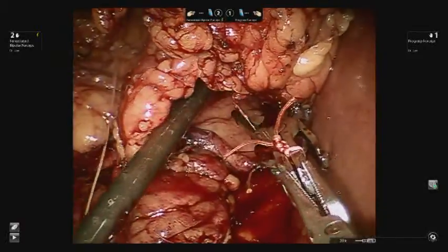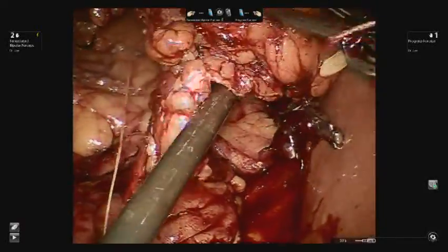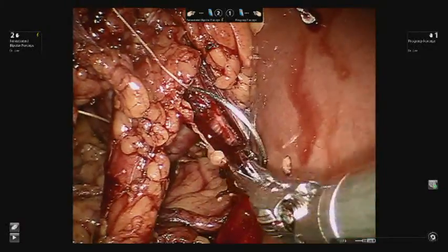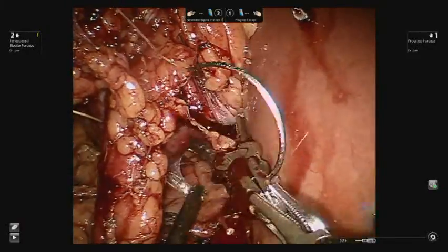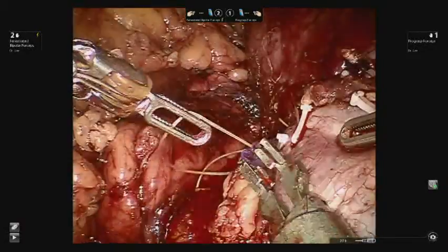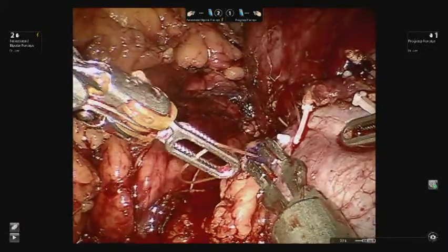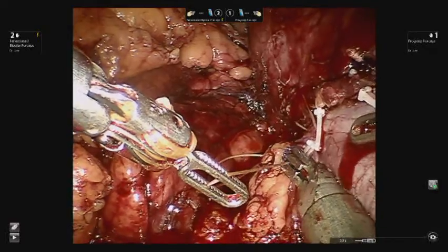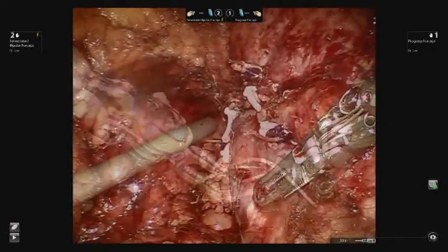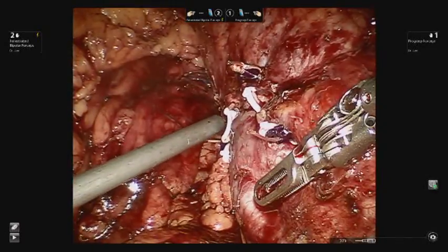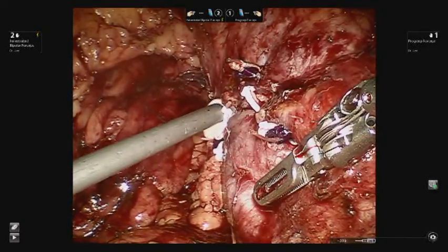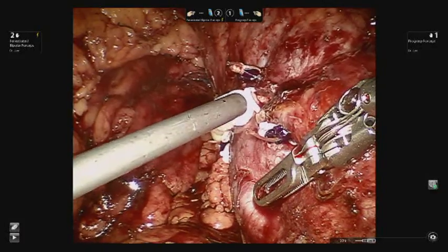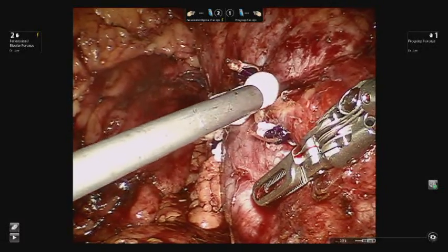The bulldog clamps are then removed and hemostasis is ensured. During this step, it is important that the patient's blood pressure is maintained at baseline preoperative levels by the anesthesiologist to assess the degree of bleeding.